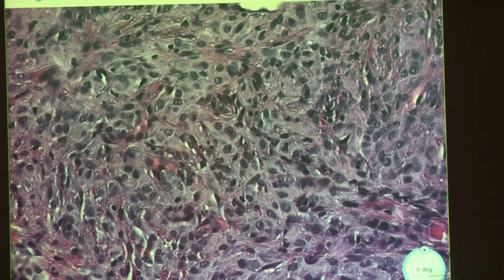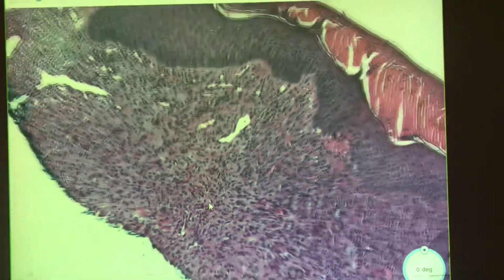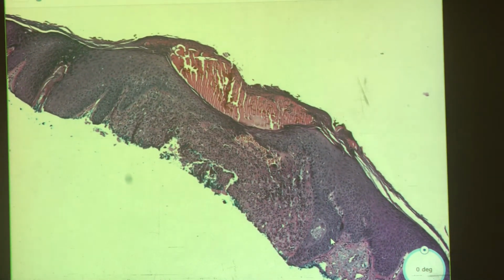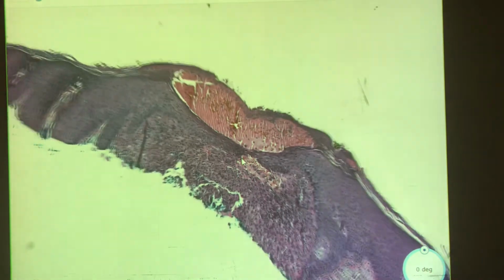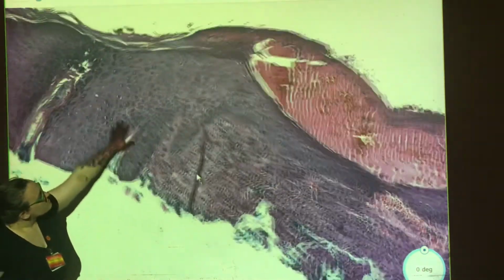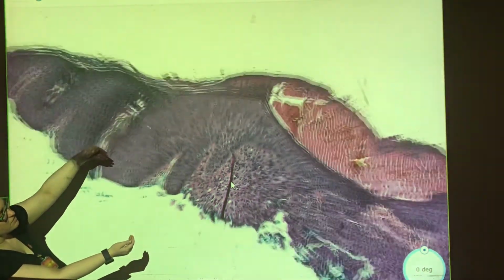Probably. There's another feature that's often seen though that is better appreciated at low power. And I think you had a couple pieces on this slide maybe. Yeah, it's better seen on this. So at low power, I mean, it's not giving me much to work with. It's enough. And anyone who does DermPath all the time, this is enough. And it's that bottom piece. So, can I help you out? If you want to zoom out, because it's easier for me to show then.